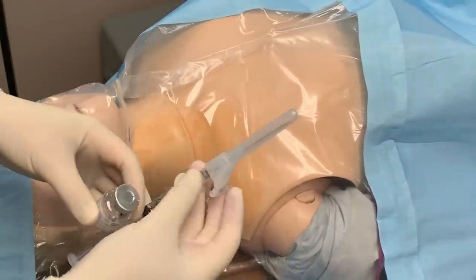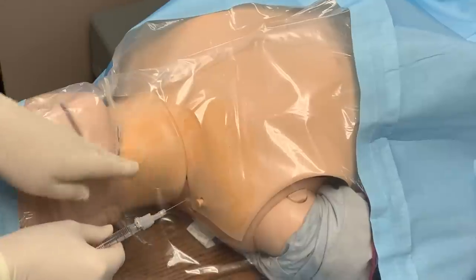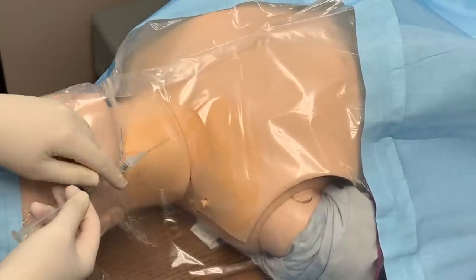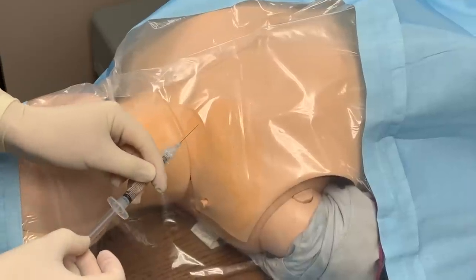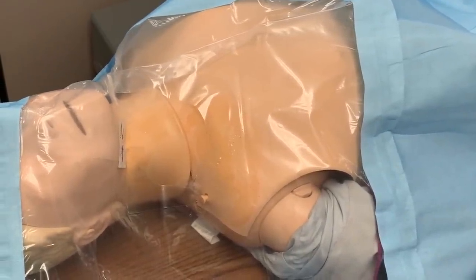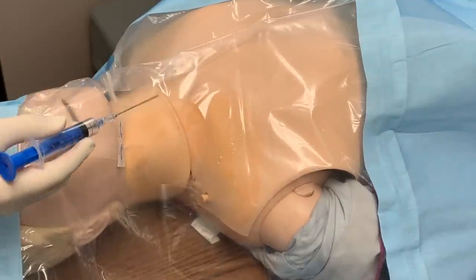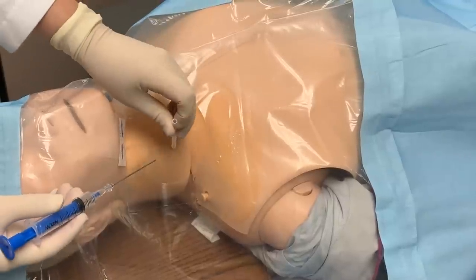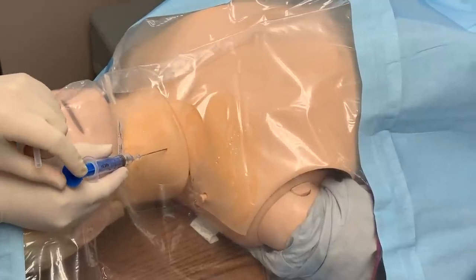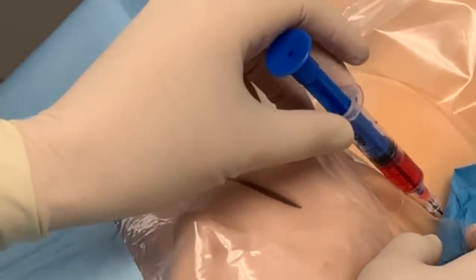We had our lidocaine — we drew it up. Pull this off and bevel up. You're going to look at your anatomy. When you're injecting, you want to stay superficial — inject and create a little bubble on the side. Always aspirate first to make sure you're not in the blood vessel, and then inject. Always protect your needle. With the ultrasound, they'll show you where the vessel is. Once you find the vessel, make a little indentation in that vessel, go in like this. When you go in, you want to be able to aspirate — that means you're in the vessel.